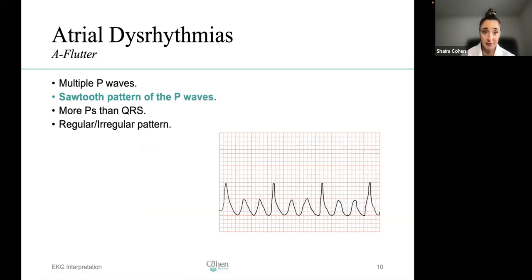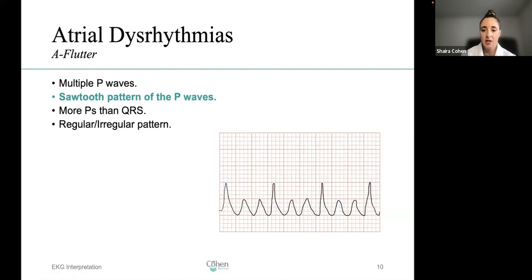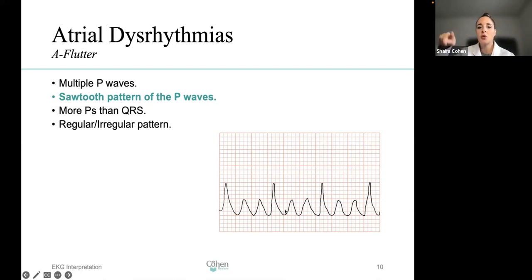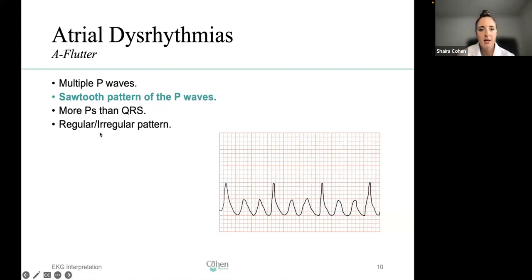Atrial flutter: the key thing to take home is that whenever you see a sawtooth pattern on the EKG strip, that is classic for atrial flutter. You'll see multiple P waves between QRS complexes in a sawtooth pattern. The QRS complex may not be super clear, but because it's taller, you can identify it. If you see an EKG strip on the exam with this sawtooth pattern, you know it will be a flutter. There are more P waves than QRS complexes, and the pattern can be regular or irregular.